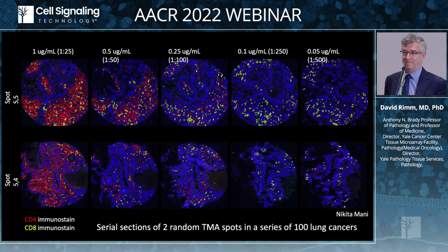But the problem is which one's right. And that I would argue you don't know unless you've optimized the signal to noise for your CD4 in this case, and then have some sort of standardization method. I'm not going to talk about standardization today. I'm a big proponent of standardization. We'll talk about that another time.